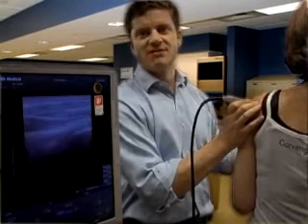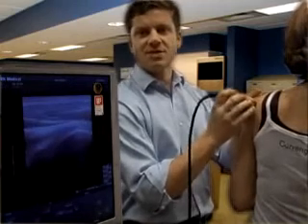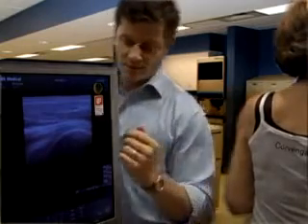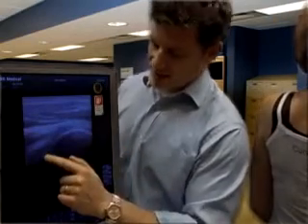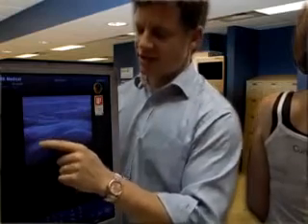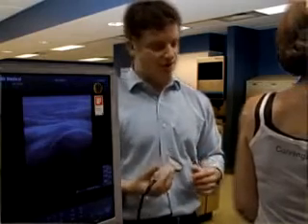You can see the circular surface of the humeral head and the infraspinatus that is attached to that. The infraspinatus is coming off the humeral head right here. The glenoid is right here. And then there's typically a triangular structure — that is your labrum. Not every patient will allow you to see the labrum.